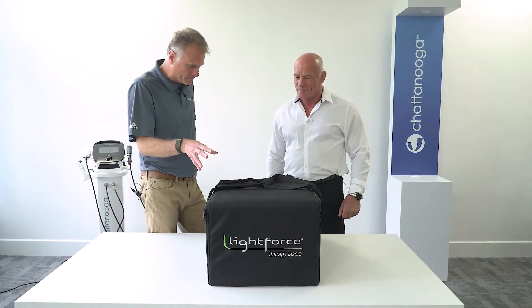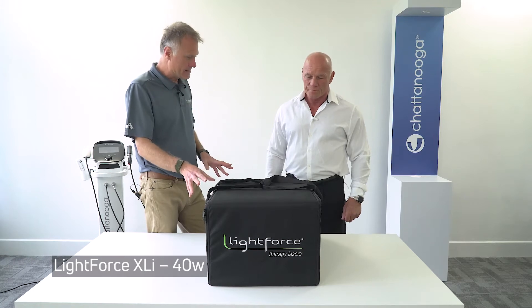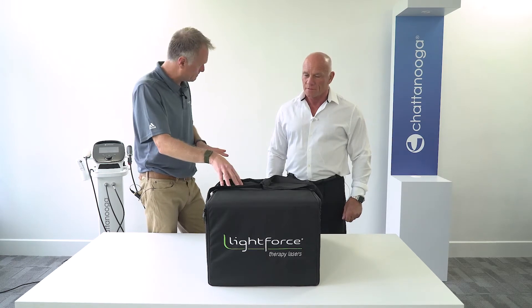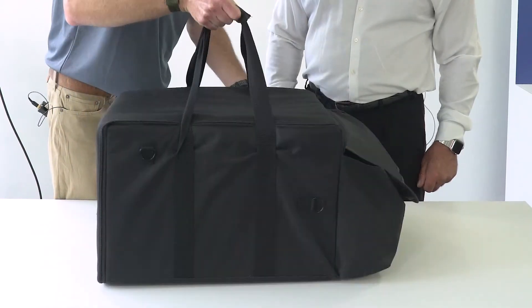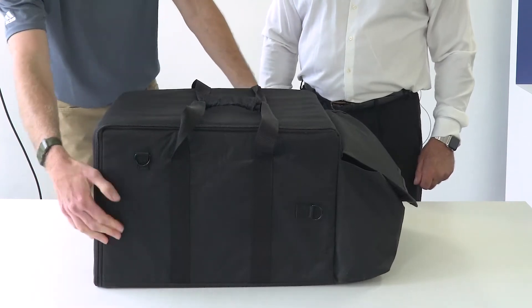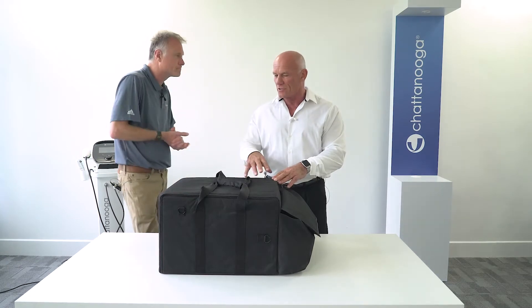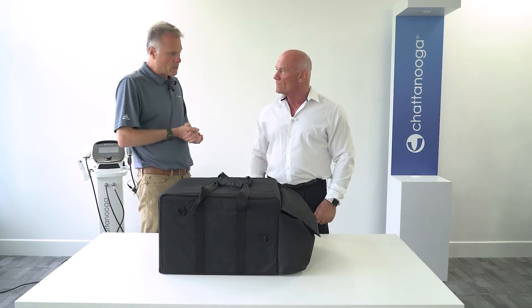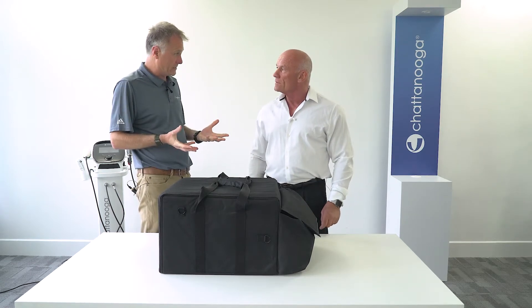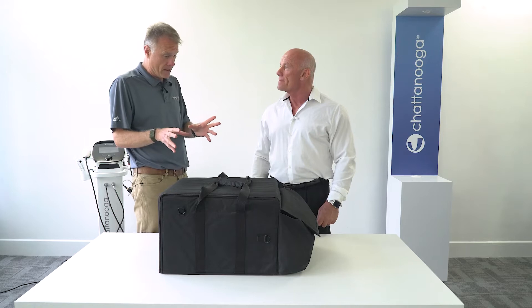This is the XLI unit and this is how it's shipped. As standard they come in these ruggedized canvas bags that you can carry fairly easily. There's also a shoulder strap that you can run between these two hooks. You could use this bag to transport the laser, but the ideal solution is a ruggedized Pelican case. For all three models there are specific Pelican cases that can be ordered separately.